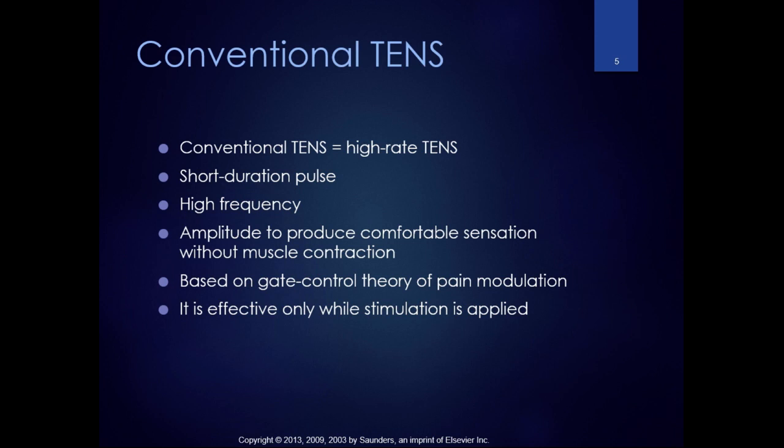Some people will say, well, I have a TENS unit I bought on Amazon. Could you show me how to use it? And then other people will say, wow, you might really benefit from a TENS unit. Here's some ideas of places where you might get one. They're so much more available and affordable now, and anybody can buy them. It's not a prescription thing anymore.